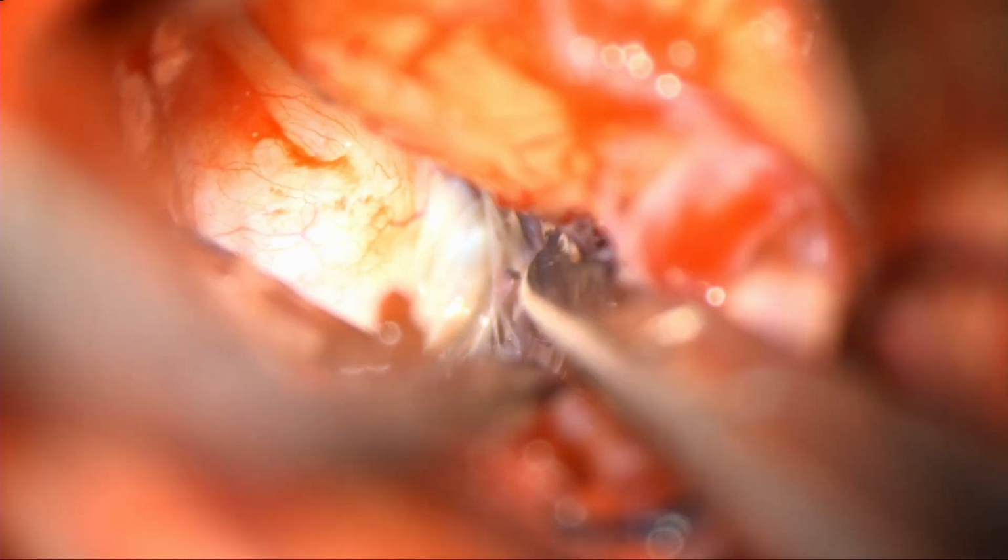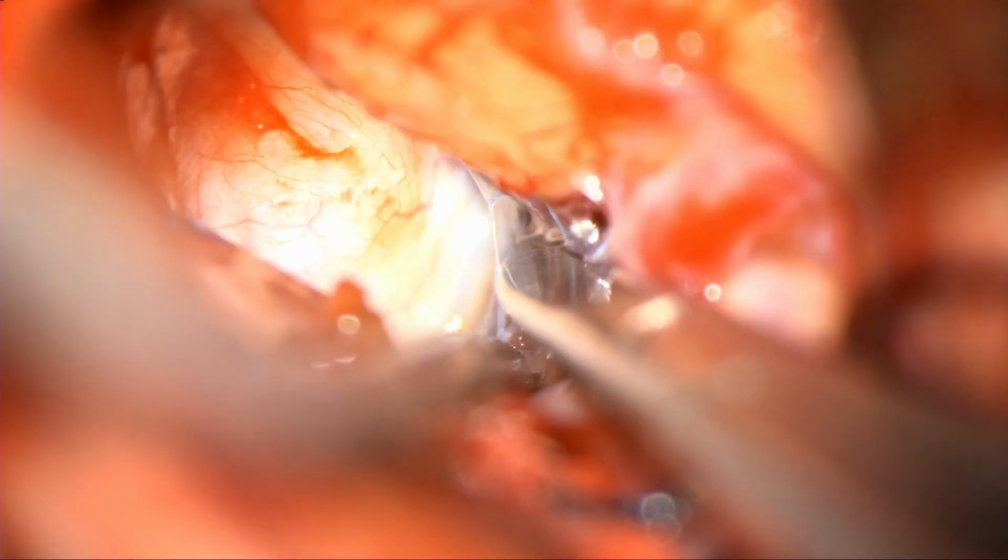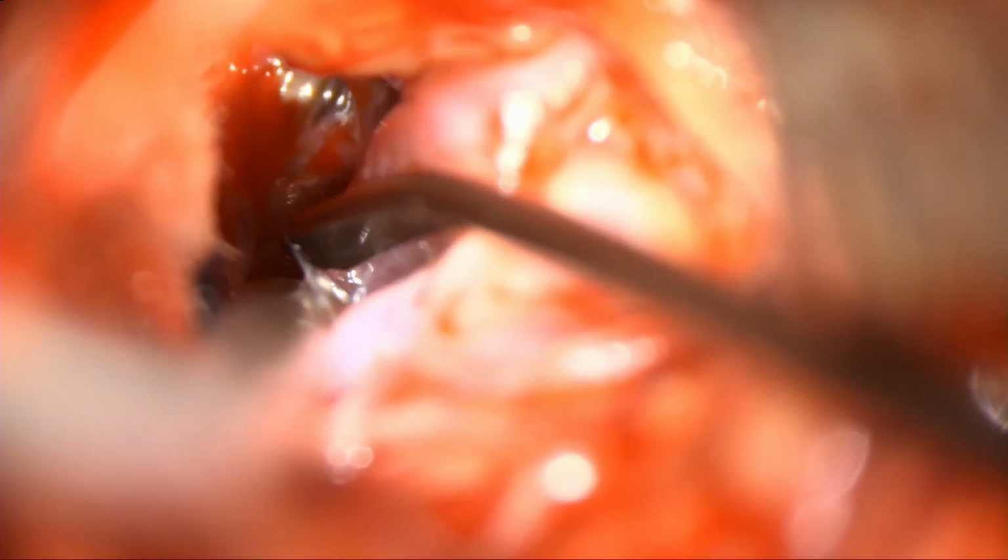You can see in the depth the deep part of the sphenoid wing and base of the anterior clinoid process. Once the frontal and temporal lobe are completely separated, we're trying to identify the origin of this anterior temporal branch and continue to track down until we are able to identify a middle cerebral artery proximal to the aneurysm.